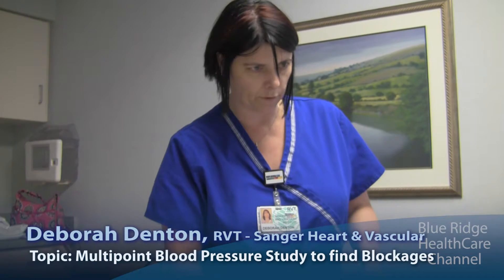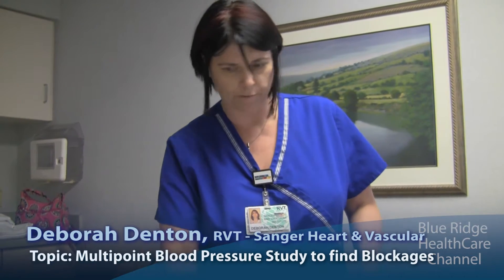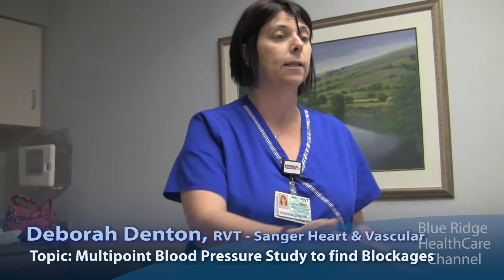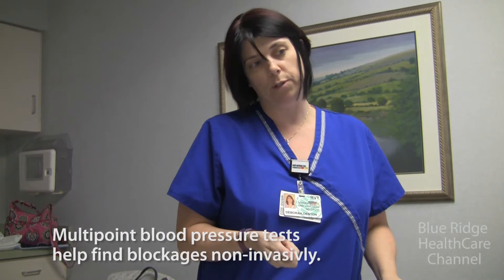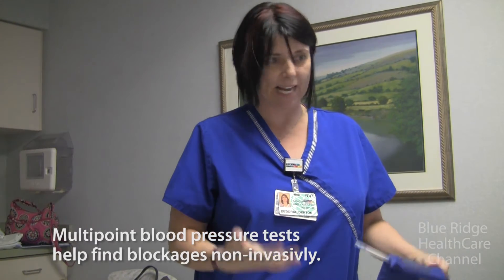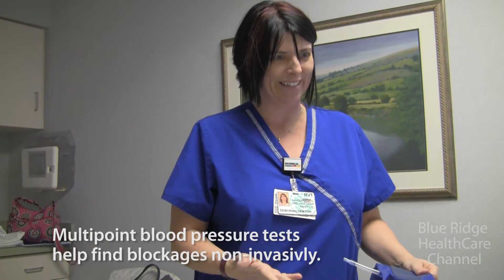We're going to take a blood pressure at your ankle, your calf, and your thigh. What we're looking for is a blood pressure drop from cuff to cuff, because when you're laying down flat or semi-flat, the blood pressure in your arms should be the same as at your ankles. A difference in blood pressure tells us if there's a blockage somewhere between the two different cuffs. We'll wrap you up in the cuffs and take the blood pressure using the Doppler — you'll hear a noise. It's exactly the same as a normal blood pressure.